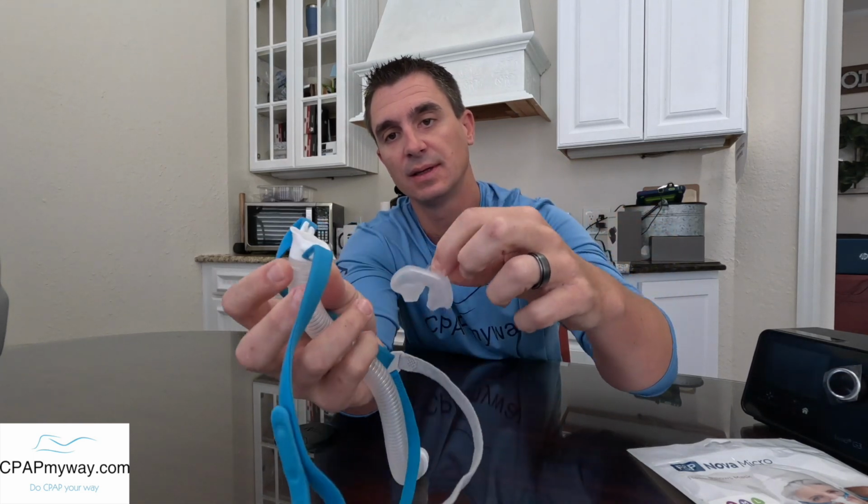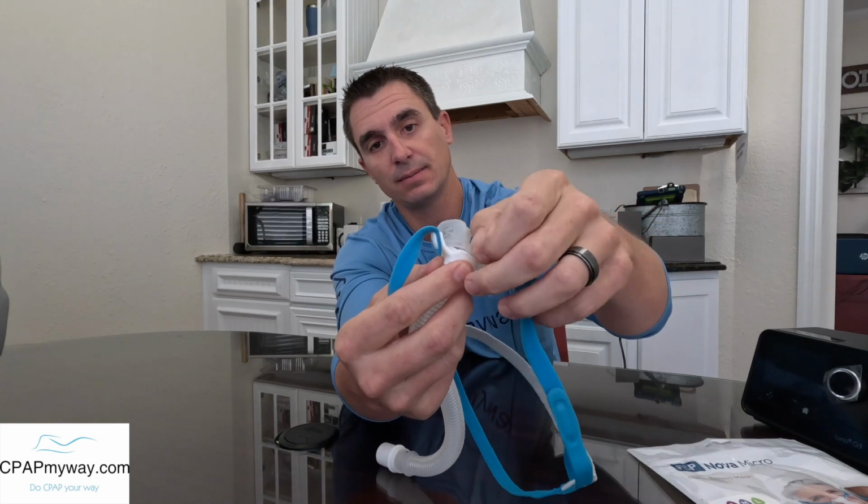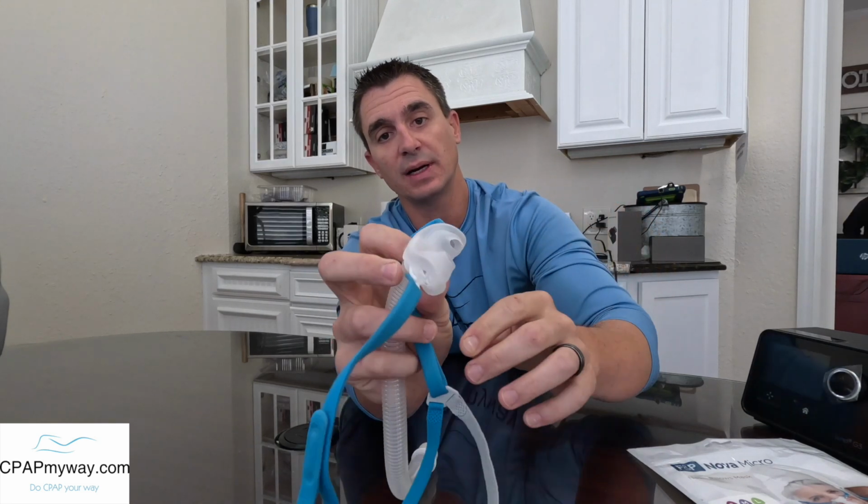All right, as far as the cushion goes, I think that's another thing that we want to point out here. You could see that as simple, or you could see that as not useful enough, I guess. I don't know. I can't decide, quite frankly. I think it is really nice that it just slips in and out there. As long as you get it right, it really just folds right into place. But a lot of people like that little snap in, snap out, so you know it's on there. So I'm not going to say that's a pro or a con.